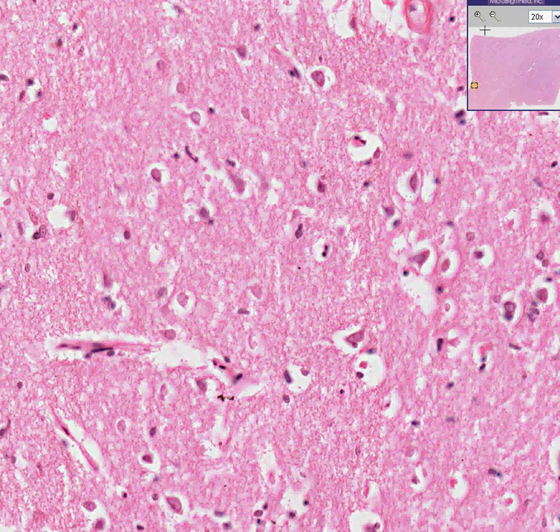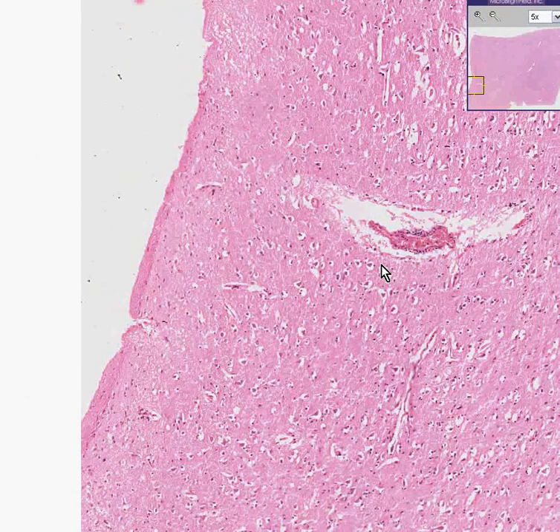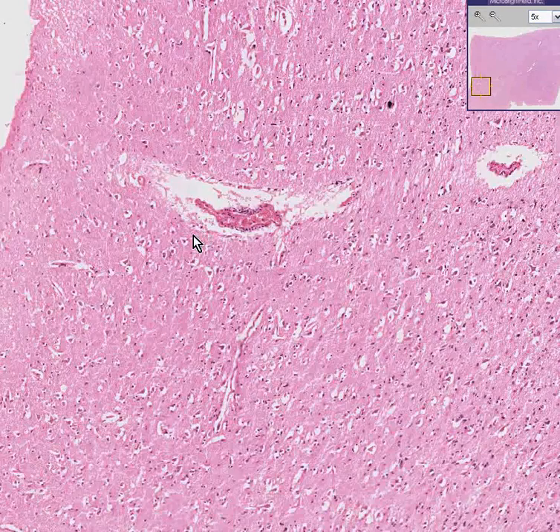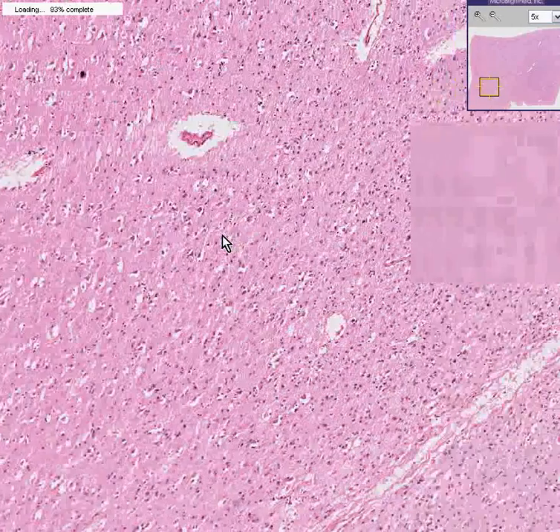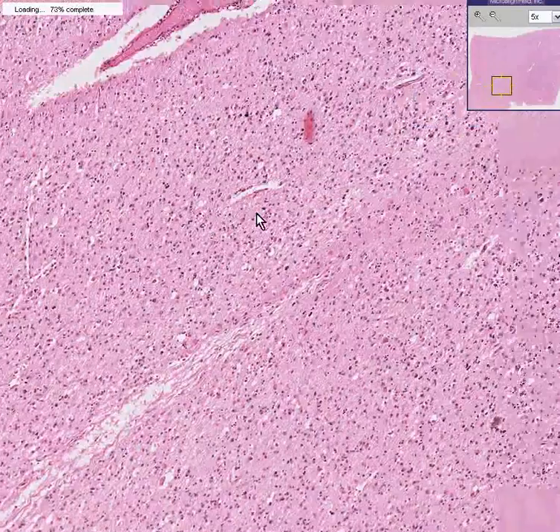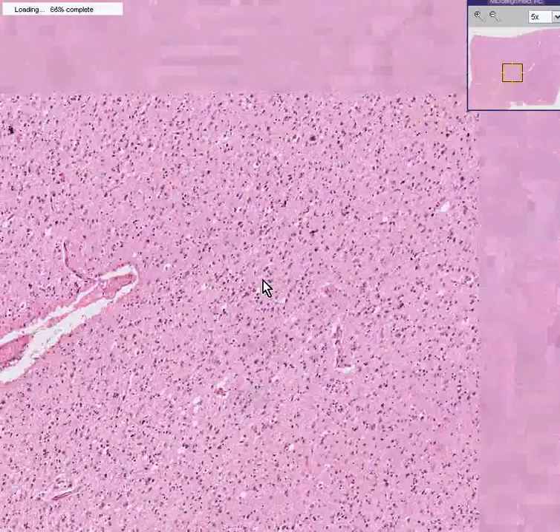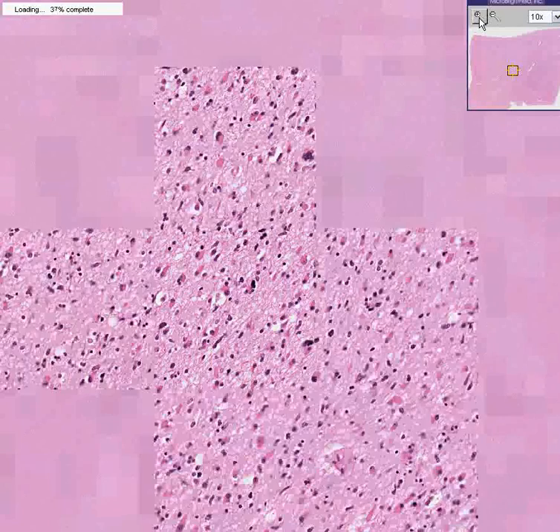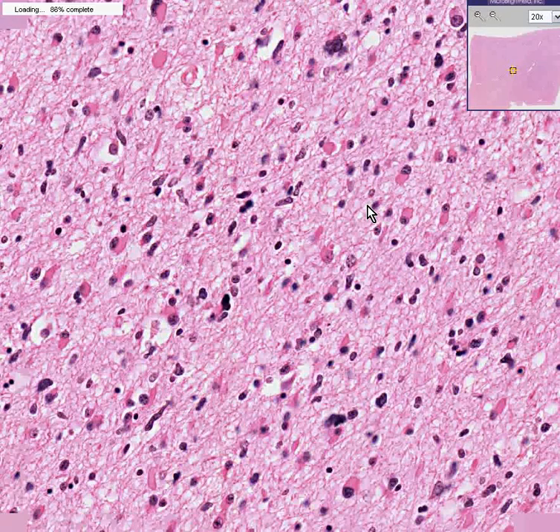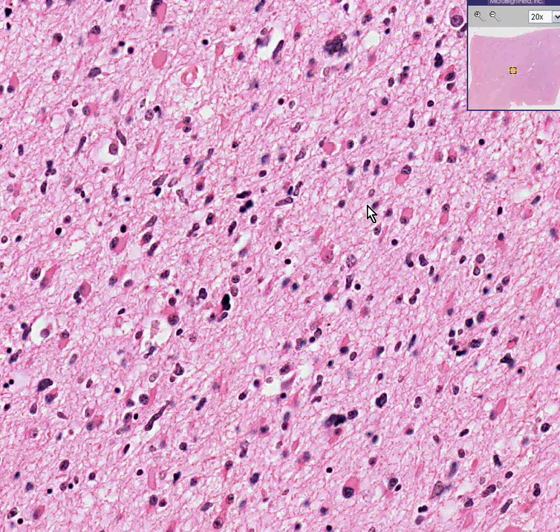But we perhaps can't see the forest for the trees, because if you take this — what you might possibly call on a good day, normal brain — notice as you go towards the center, all of a sudden the cellularity of glial cells, mostly these small nucleated cells, increases drastically. And now you are in a quandary and you have to say: are these a lot of glial cells because they are reactive to something, or is this a low-grade glioma, the most common type of brain tumor?